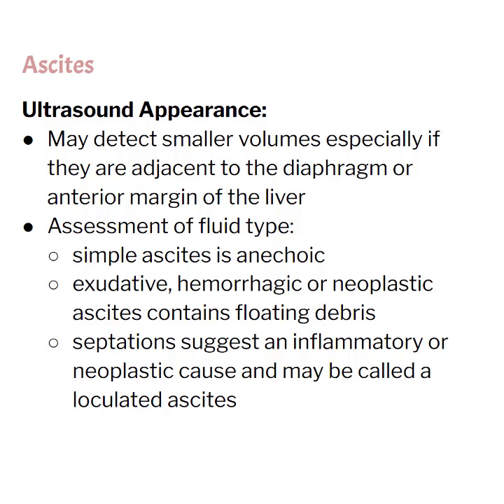On ultrasound then, we will see pockets of fluid within the abdominal cavity. We need to be conscious of very small pockets. Sometimes those are going to be right next to the diaphragm, sometimes in Morrison's pouch. Sometimes you'll see it right on the left lobe, kind of in between the stomach and the left lobe, are common places that a little bit of fluid likes to hang out. Otherwise, when it's just a massive amount of fluid within there, you're going to see a large amount of anechoic fluid, typically then with bowel floating within it.